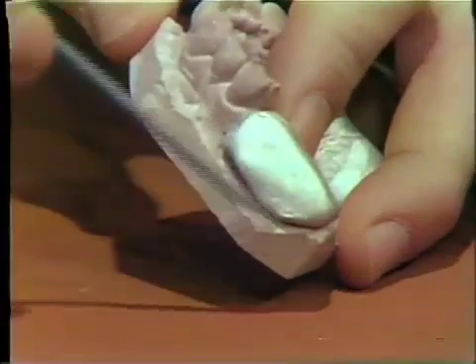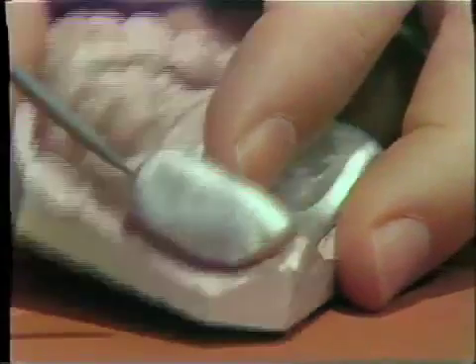Once you have the tray fabricated, it is taken to the mouth and checked to see if it fits and does not impinge on the soft tissues, especially in the peripheral areas. If it rests in there without disturbing the patient, then you're ready to take your mucostatic impression with the impression cement.